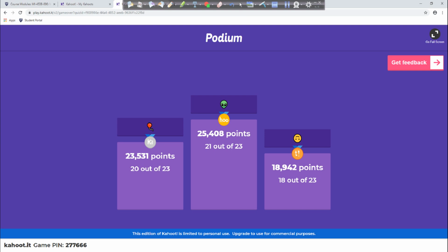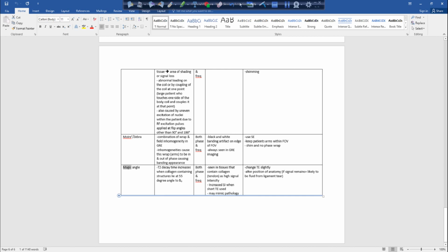And then I just need to mention one other thing. So there is another artifact. This artifact, partial volume.